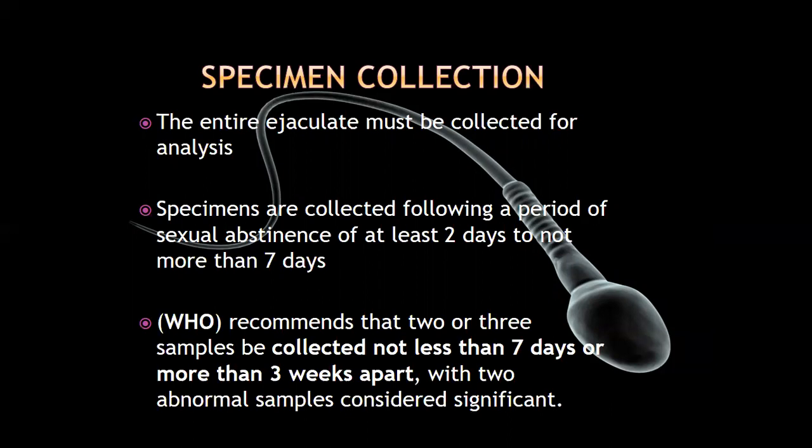Now, the patient preparation for semen analysis specimen collection is as follows. First and foremost, I need to emphasize this: there must be a period of sexual abstinence.